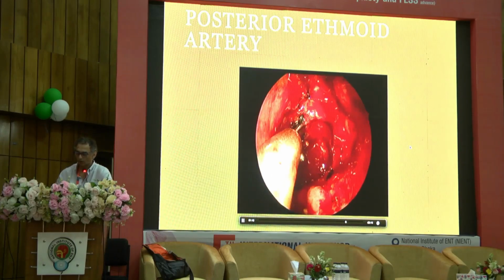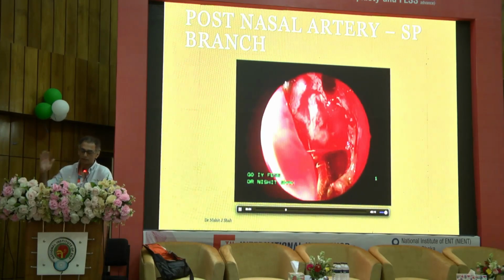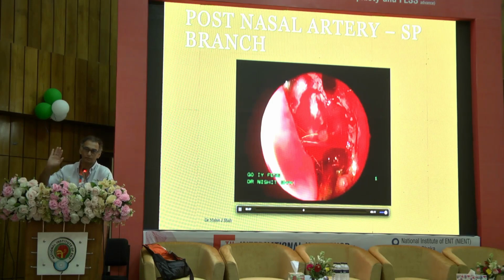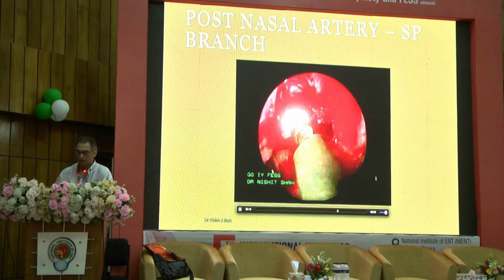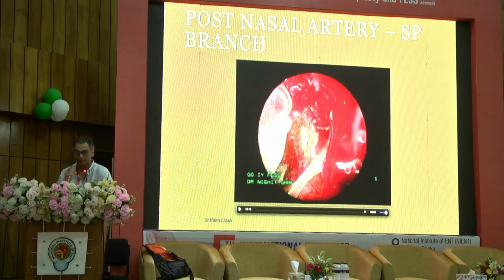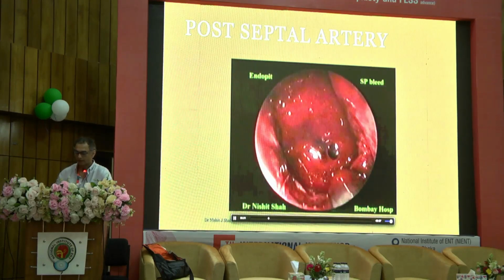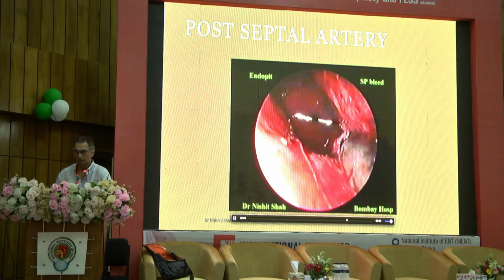From there we go to the posterior. This is when you go lateral and posterior from the maxilla. If you go about half a centimeter from the posterior maxillary wall, you can get this lateral branch of the sphenopalatine, which you need to cauterize. So I've tried to show you different ways of dealing with hemostasis. We had bipolar, we had a second-hand bipolar, and we have a unipolar probe here, and you just cauterize it because here you're nowhere near the skull base. Sphenopalatine branches, you're okay. Again, for a sphenopalatine vessel here, you can use an insulated suction and cauterize it. No big deal here. It's easy with one hand especially.